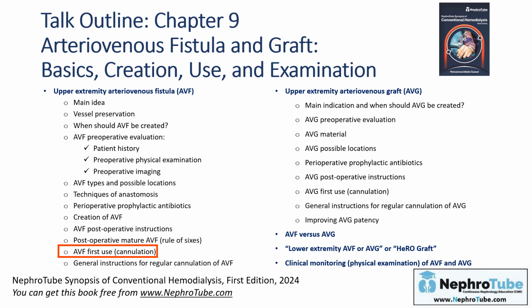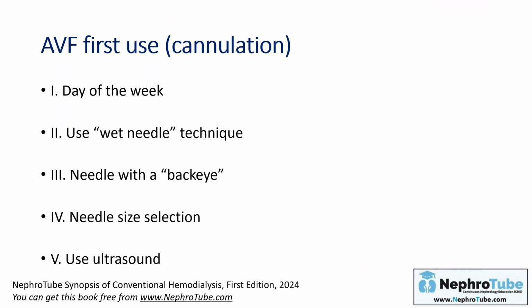So what are the recommendations for AVF first cannulation? These recommendations were mentioned before by the KDOQI Vascular Access Work Group 2006, and they are still standard till now. There are 5 points we have to mention regarding the first cannulation of the fistula.